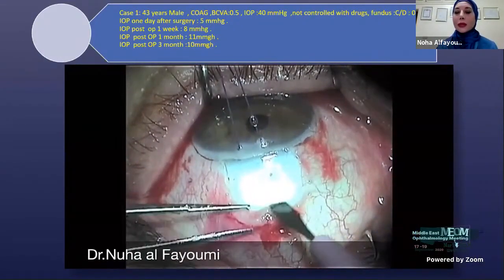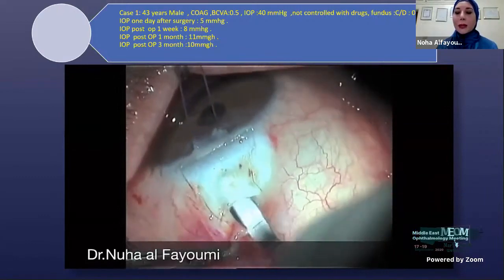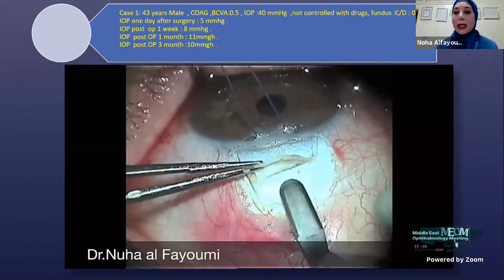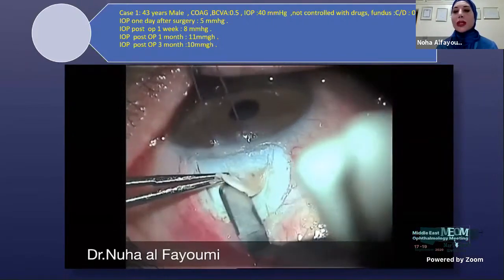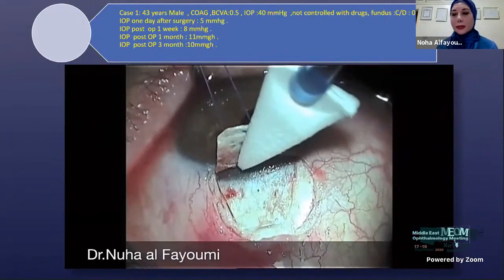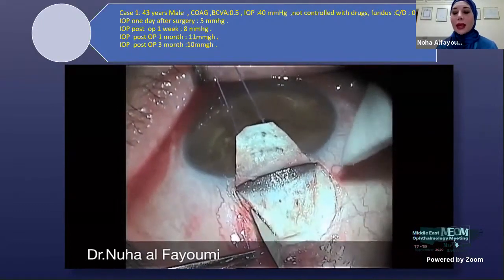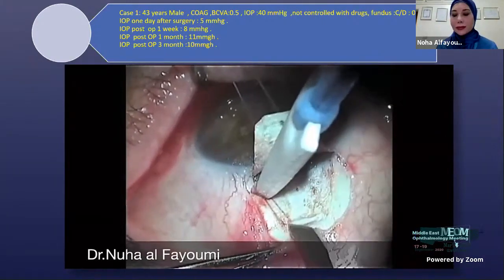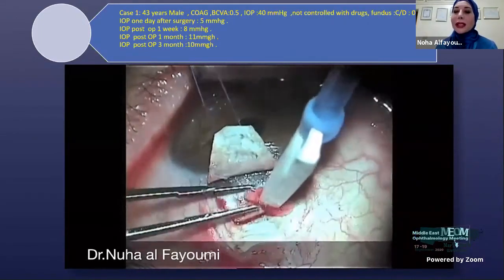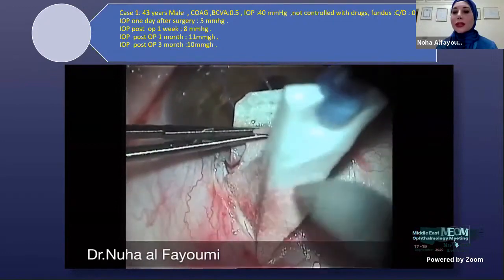First, we expose the eyeball by placing a suture at the limbus, then open the conjunctiva at the limbus also. Superficial flap with thickness equal to one third of the sclera, and we have to dissect it 2 millimeters into clear cornea to allow good exposure of the trabeculo-Descemet plane. Deep flap identified by the dark color of the underlying choroid, and then identification of a very important landmark, the scleral spur, pearly and shiny fibers oriented concentrically to the limbus.